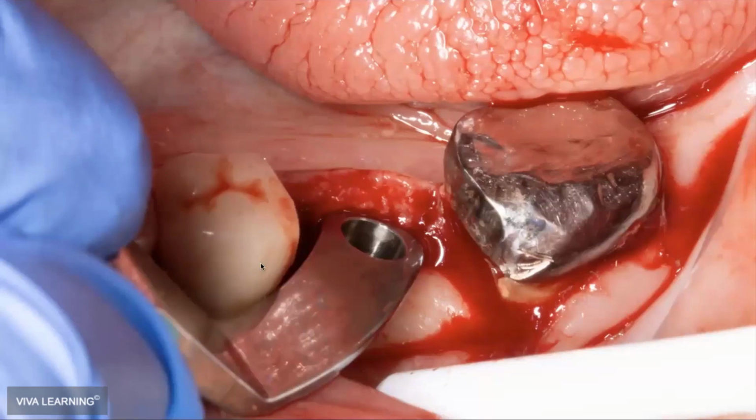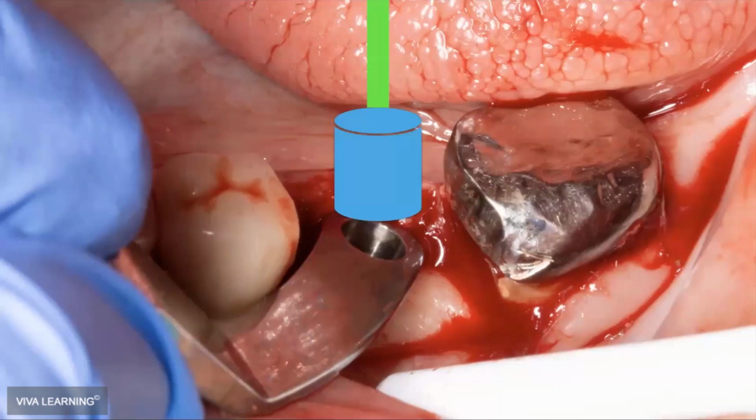So I took my guide out and I put the key into the bone, and just that distance between starting way up here, like 6 to 8 millimeters higher, and having it have to go through a tube and then hit the bone. That's why I made the decision to put the key into the bone. My visibility got a little bit better.